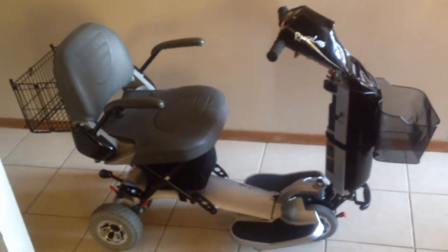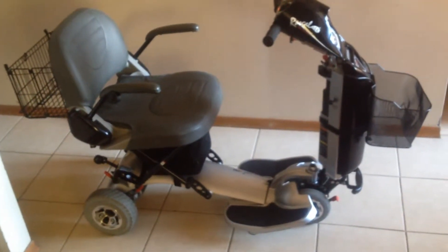Well guys, my super spectacular Rascal AutoGo 550 — let's go through it.